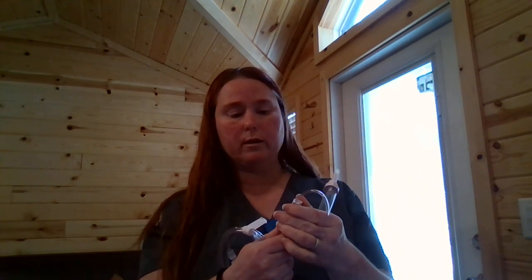So now I've opened my gravity set, which I have here, and this here is the spike end. Then this will be the drip chamber. This is the roller clamp, which will help me control my rate.